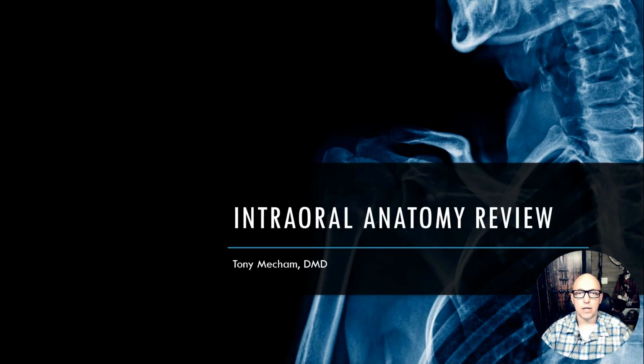to radiology anatomy. I'm specifically making it for my second-year course, which is an interpretive course, because what is paramount to interpretation is recognizing anatomy. So you have to know anatomy to recognize what's abnormal, and then we'll get into describing, and then we'll get more into the interpretation of lesions.